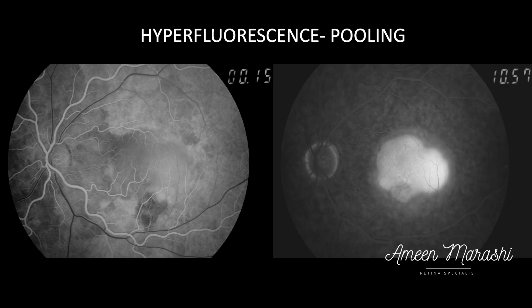Hyperfluorescence has several types. How do we differentiate pooling from leakage? The principle of pooling is the accumulation of dye in a defined space, as in this example of a serous pigment epithelial detachment with subretinal fluid.